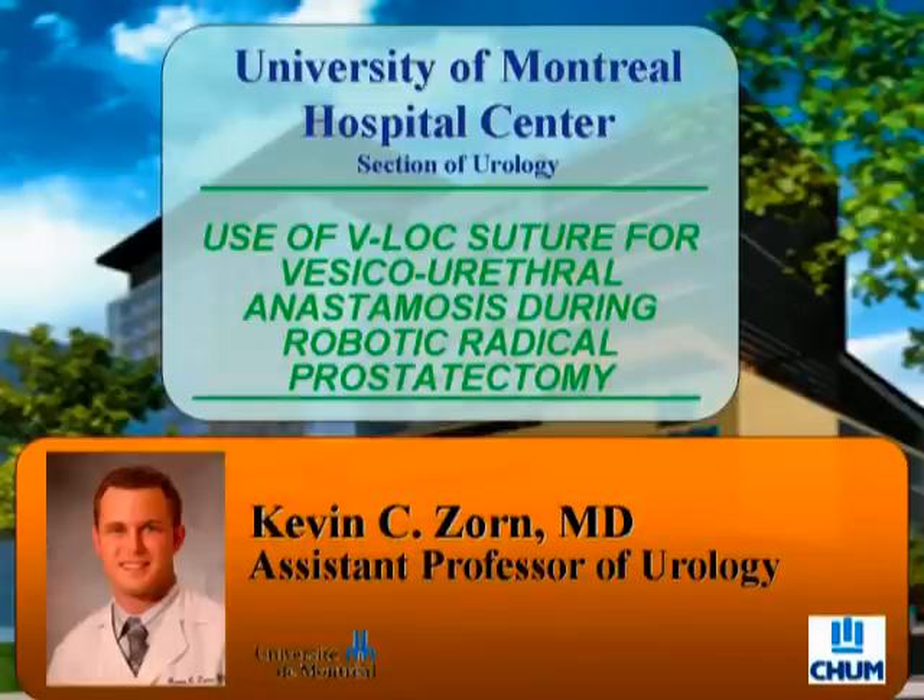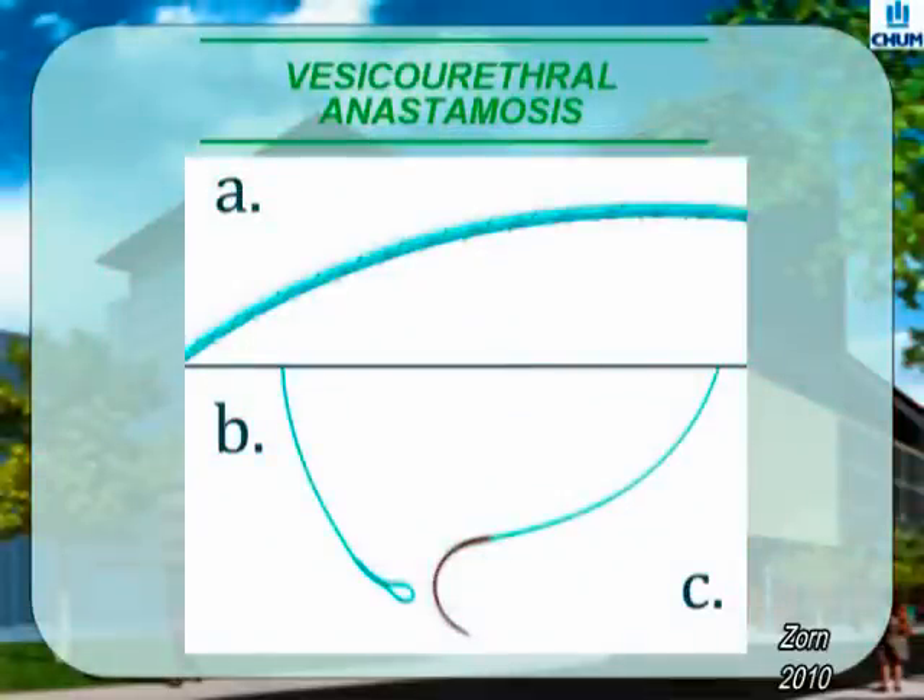Use of the Covidian V-Lock Suture for vesicourethral anastomosis during robot-assisted radical prostatectomy. Surgery and narration by Dr. Kevin Zorn. The V-Lock Suture is a novel self-retaining suture with unidirectional barbs. It is also unique in that it has an end anchoring loop to eliminate knot tying. The material is completely absorbable and is enzymatically degraded within several weeks.